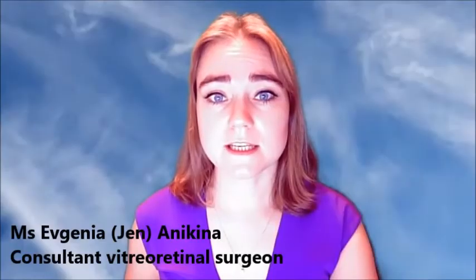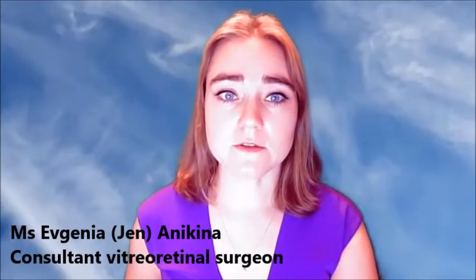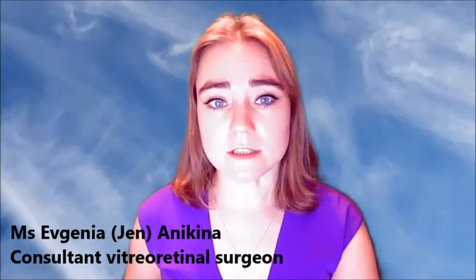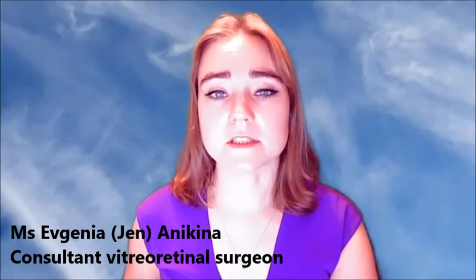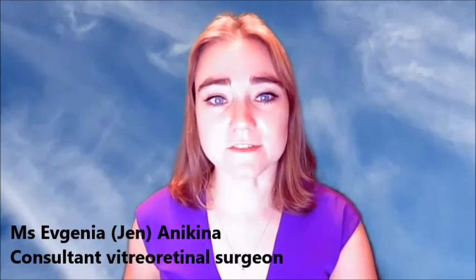The vision will take some time to return to normal, which can be anywhere from a few days to several weeks. Initially, the vision may be worse than when you started, as the eye recovers. You will need to take some eye drops and may require stitch removal at a later date. This can be done quickly and painlessly during a clinic appointment. Your surgeon can advise you what to expect in your specific situation.